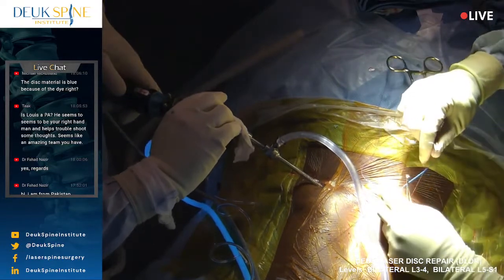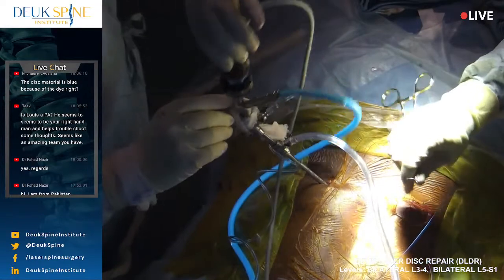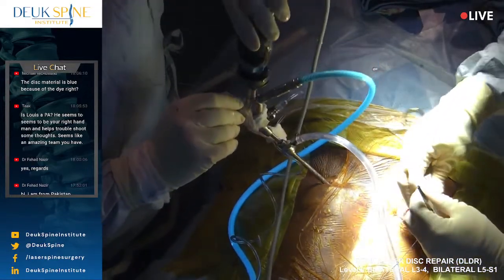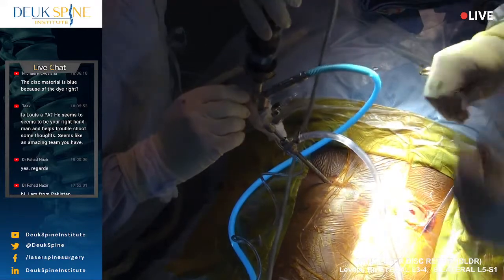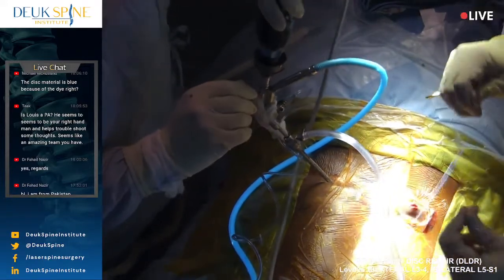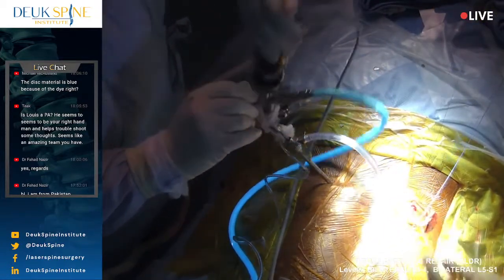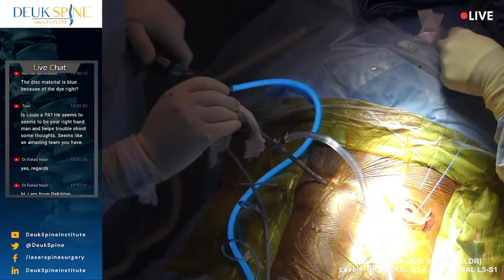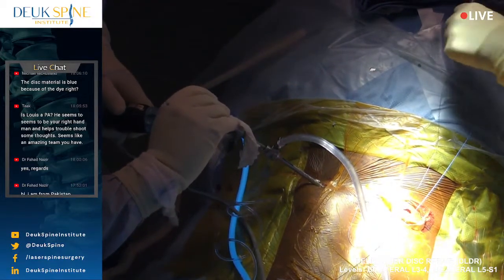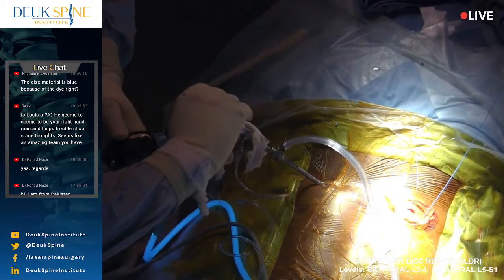Again, this is that disc that's really scarred up. Not like the last one that was a complete soft blowout, like a jelly blowout. This thing is scarred up from years. This is the 9-year-old injury disc. The other one is something far more recent. It's not uncommon for patients to have disc injuries at different times that are different ages.